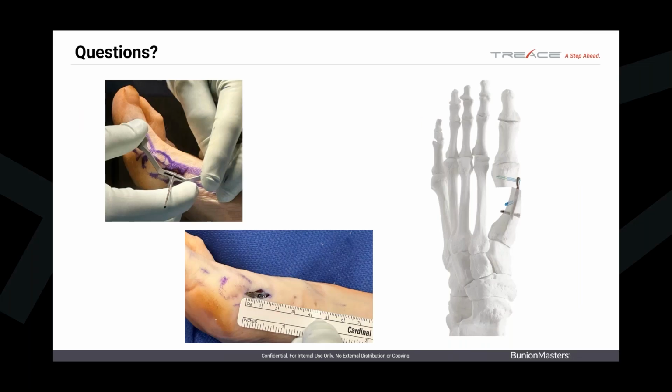Any concerns, Dr. Loder, about standing the plate up too much and point loading on the medial cortex with that proximal tip? Yeah, you don't want to overstand it. Absolutely not. You don't want to go too far, because on top of that, what it does is it drives your distal screws too close to your osteotomy. So you've got to be careful about that also. So you want it standing up in the metatarsal, snug against your metatarsal head, and closely parallel to the second, but not completely.